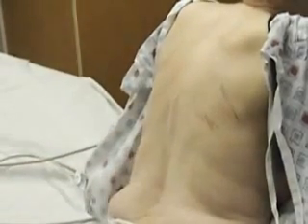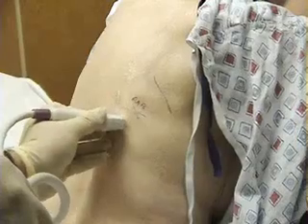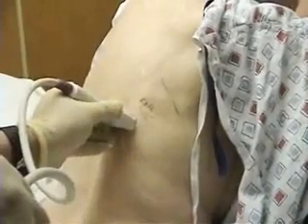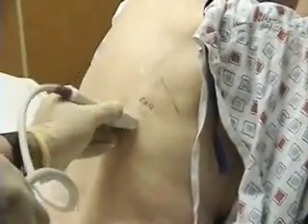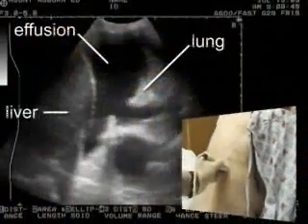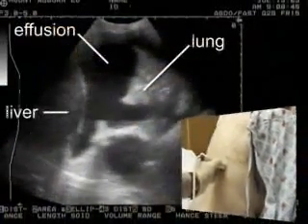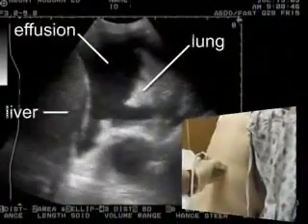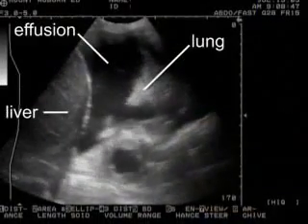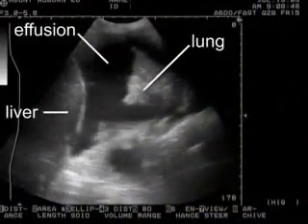The needle should not be inserted below the ninth rib. If available, bedside ultrasonography can be used to help visualize the effusion. In this patient, the pleural effusion is easily visualized, as are the ipsilateral lung and the liver.